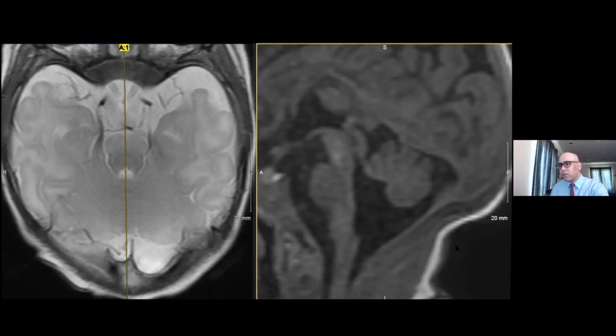I think that's important because there's a lot of confusion about terminology of the posterior cranial fossa malformations, in particular the Dandy-Walker spectrum malformations. And not every person is going to say the exact same thing. And not every book that you read is going to say the same thing. So if you're appropriately descriptive, saying a mild severity Dandy-Walker spectrum malformation, I think that's helpful. I think that's appropriately descriptive. And findings such as this very often can be clinically silent.